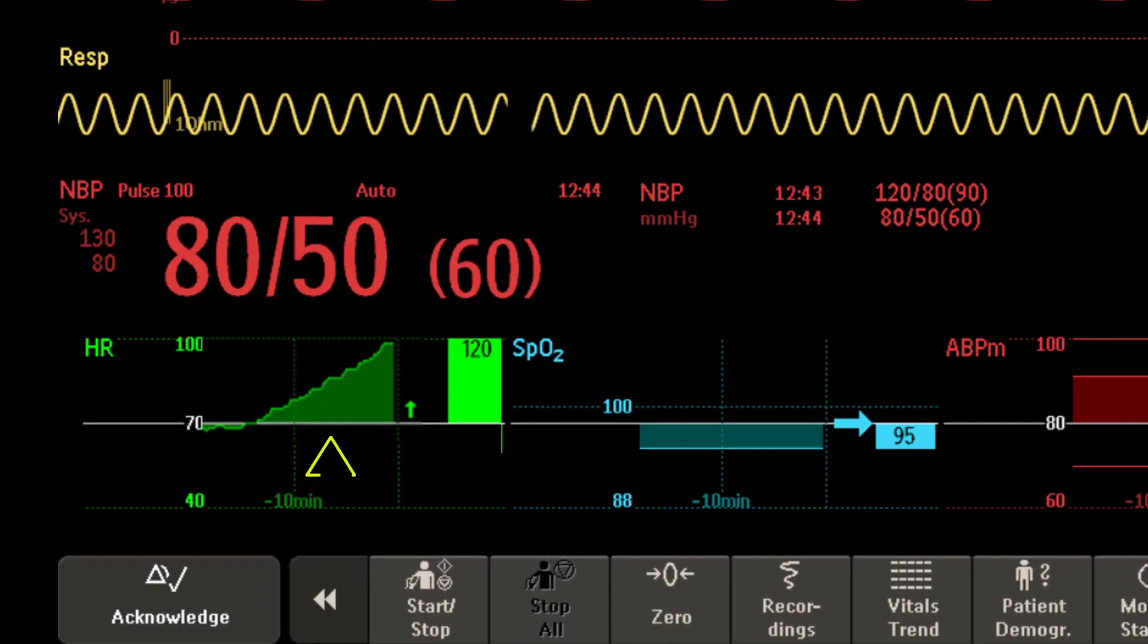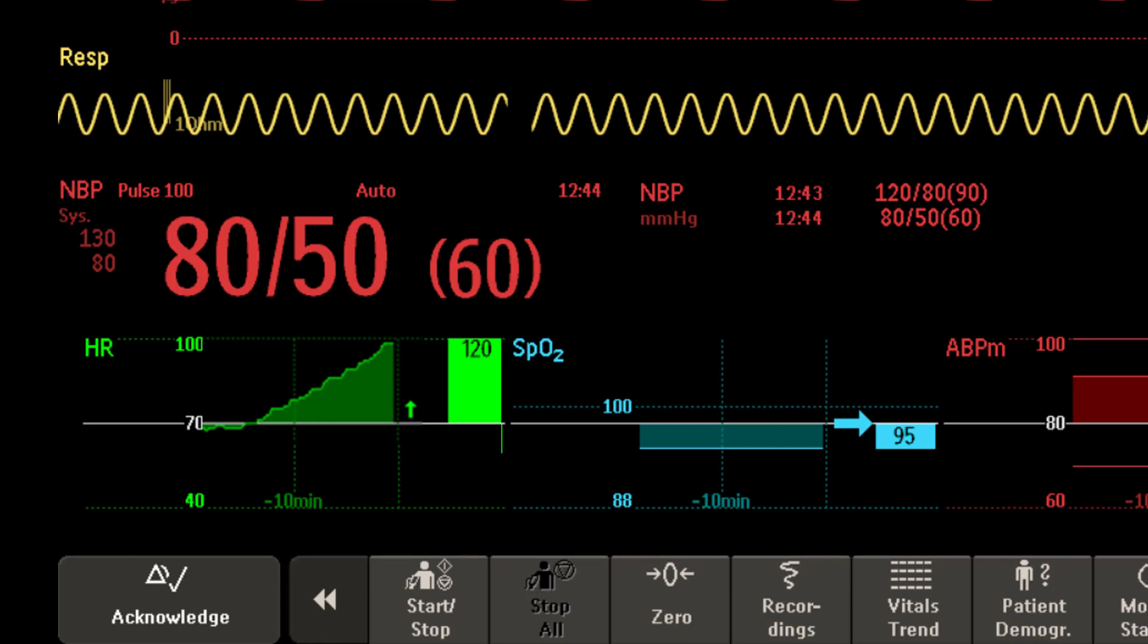You can see a graphical trend, a trend indicator arrow, and a deviation bar. The trend arrow indicates how the patient trend has developed over a set time period.